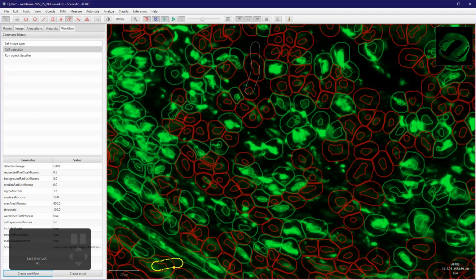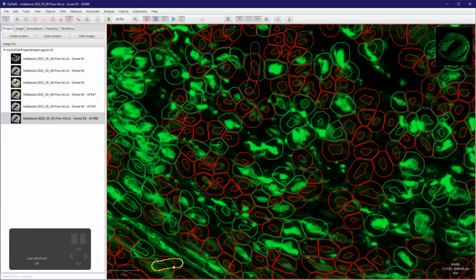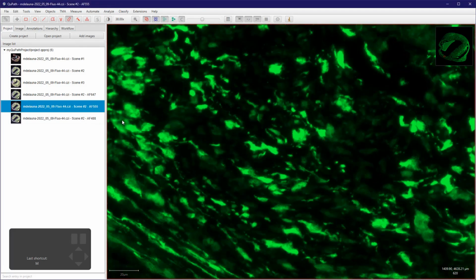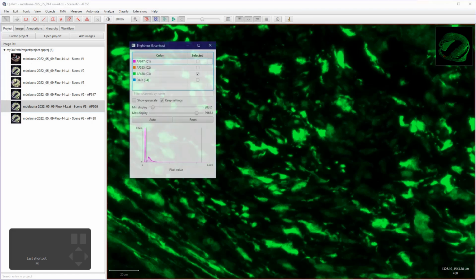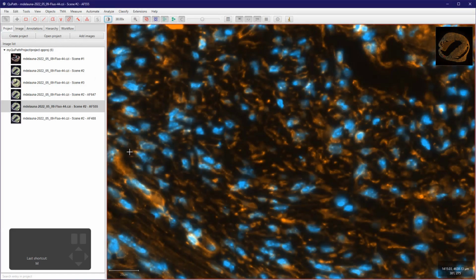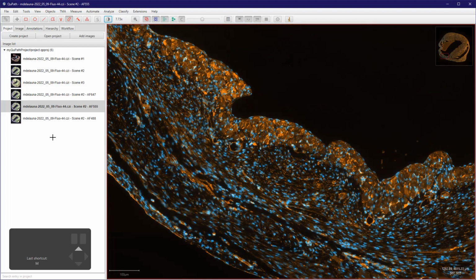So let's go to the other channel. Save the changes here. Yeah, we can see it. Now this one is the orange channel, and let's do the same as we just did before.